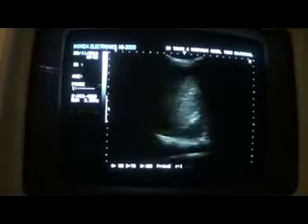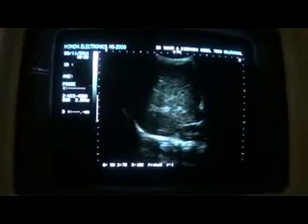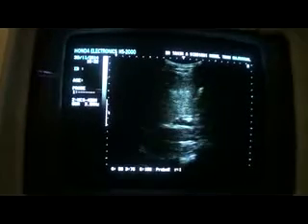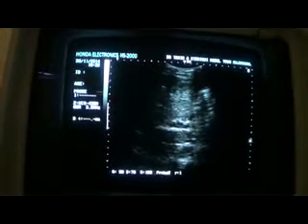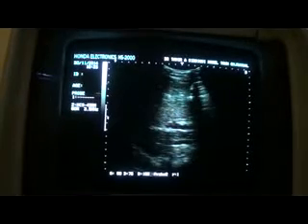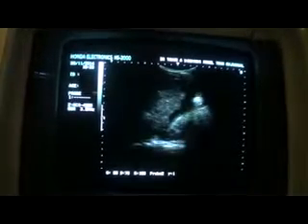This is a vessel. You can see the sharpness of the vessel, and there is no coarseness. One must also see the diaphragm. You see this diaphragm is not that thin, and moreover in this case see the portal vein. This is the portal vein. Its outer surface shows normal periportal echoes, and then compare it with the kidney.